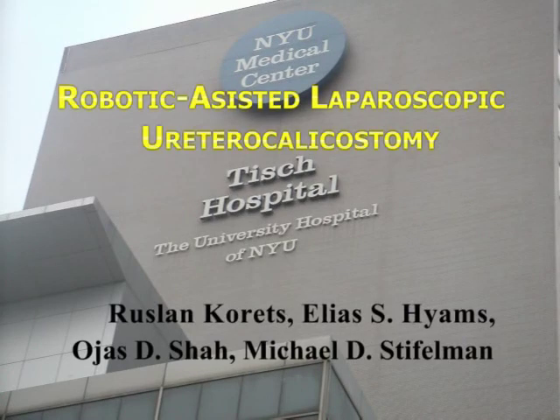In this video, we will describe a robotic ureterocalycostomy to repair an obstructed UPJ.